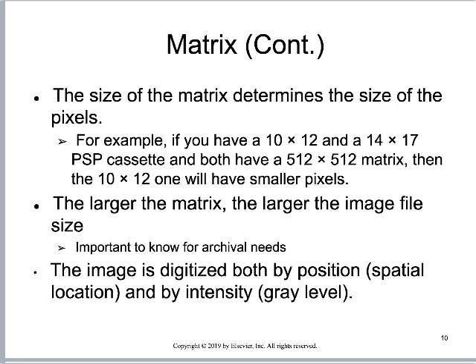As we cone in on the patient, we are reducing patient dose, we are improving image contrast, and we're improving spatial resolution because we're making the pixels smaller. I'll make sure to get that in bold writing on a slide at some point because it's a big takeaway. I think understanding that connects a lot of critical thinking stuff for us as we're talking about digital.